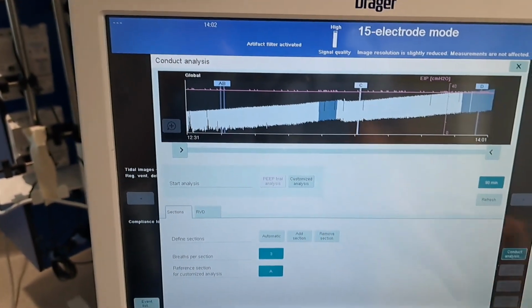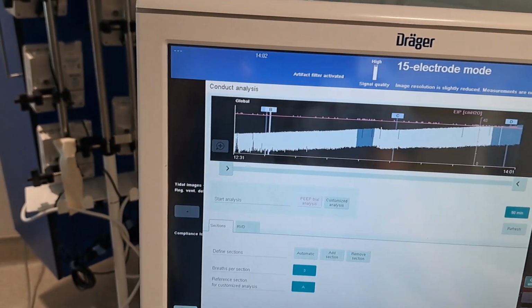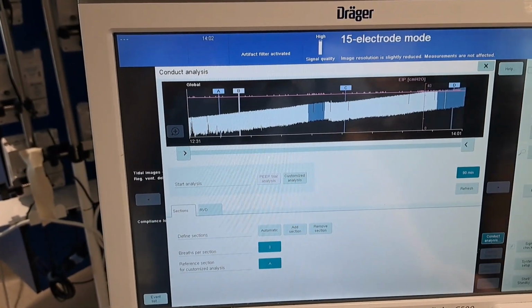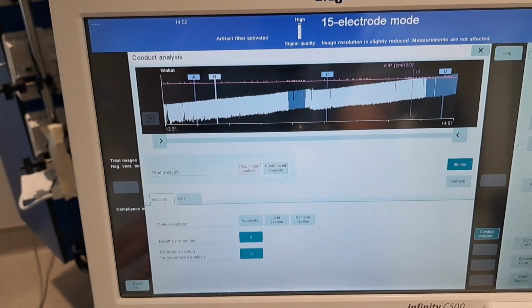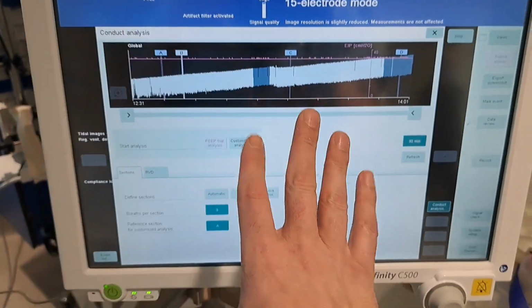We have to take into consideration the pleural pressure and the transpulmonary pressure, and I don't have a transesophageal balloon to measure the pleural pressure. But with the PulmoVista, you can get regional compliance. So if I was on an island and I had a choice between a transesophageal balloon to get the transpulmonary pressure or the PulmoVista, I would choose the PulmoVista.